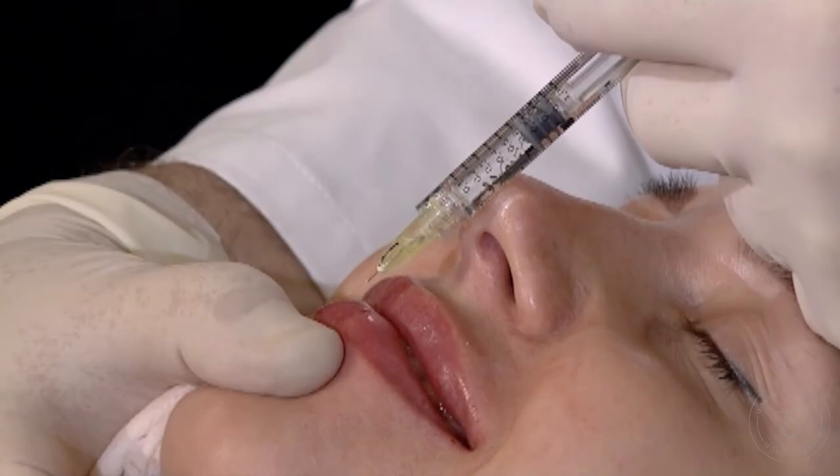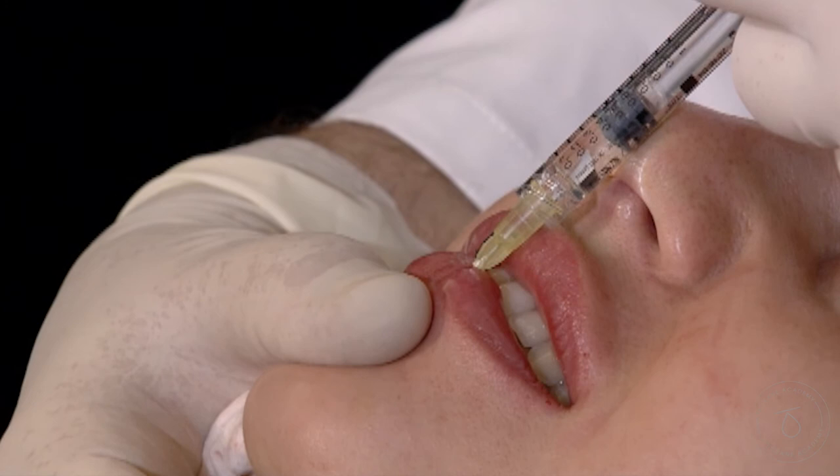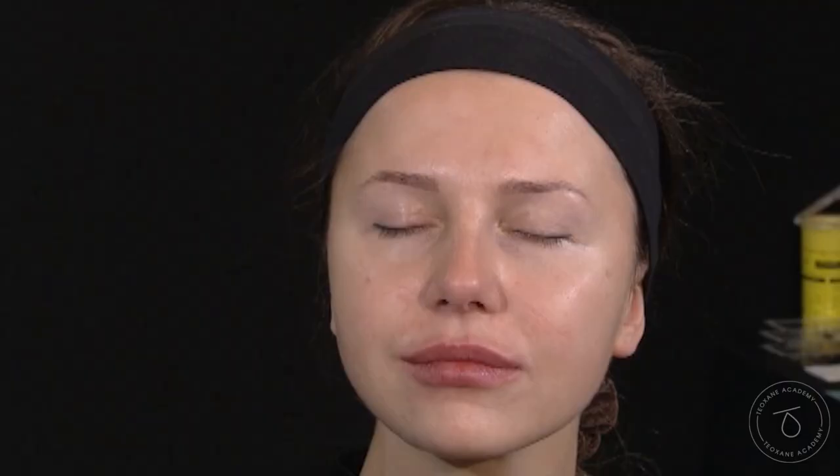You see the juicy lips now? I give my sexy drop — I go even higher now than before. I press the upper part of the lip here, tangent, underneath the mucosa, and I plump. Same technique then for the upper lip. Quite sexy.